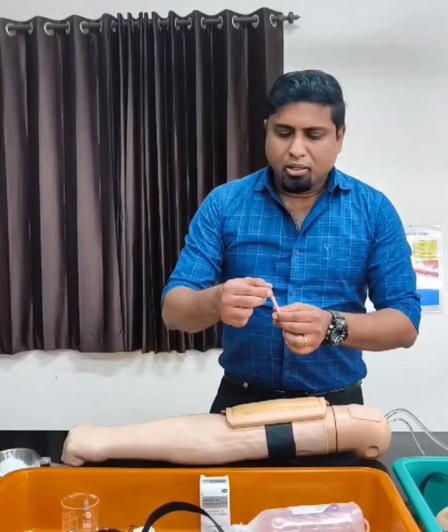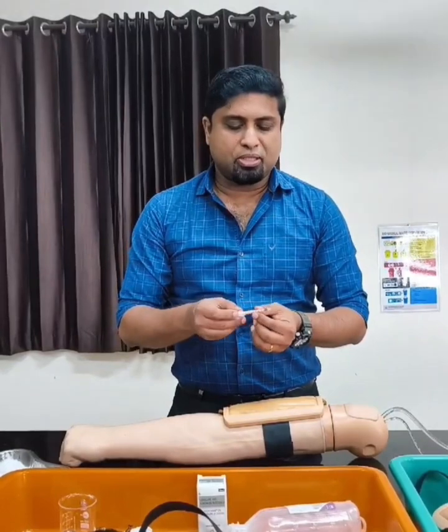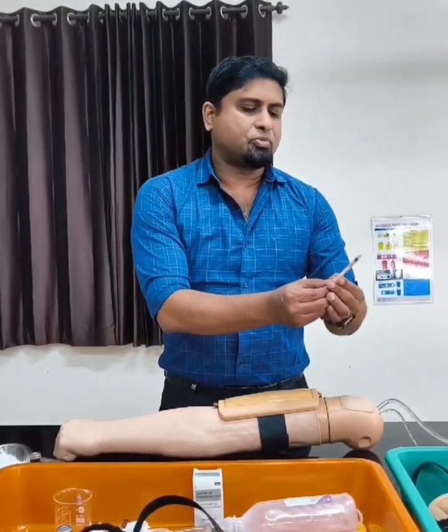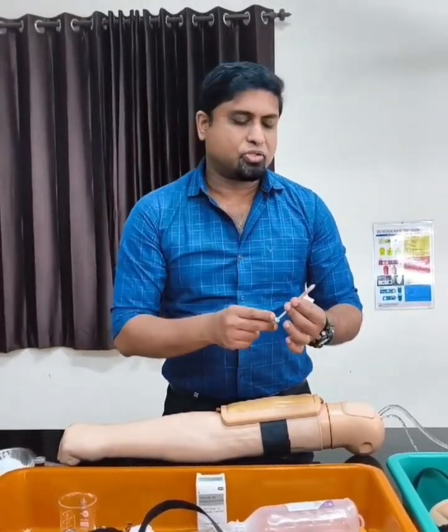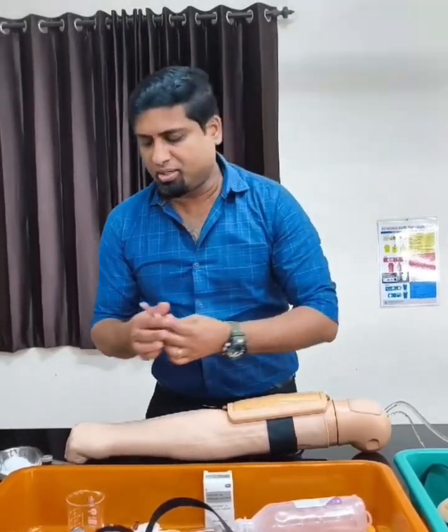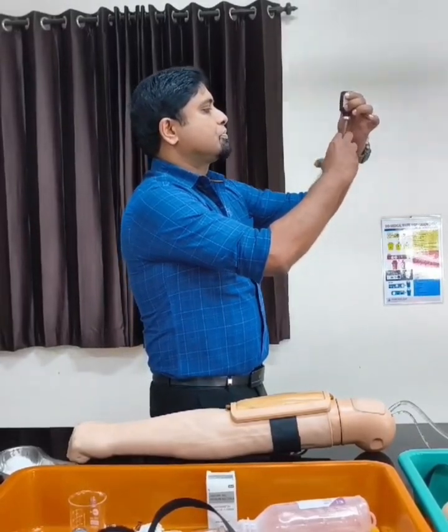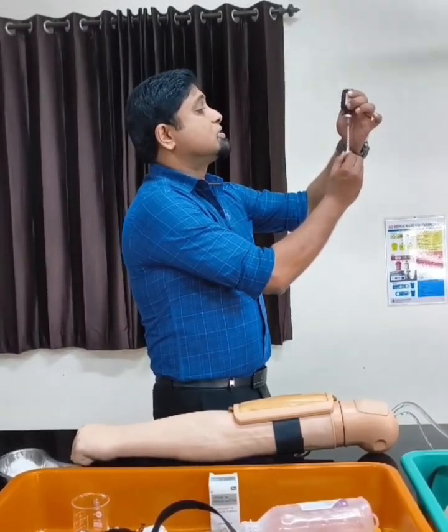So, the patient should be advised to draw insulin from the vial. So, let us say the patient has to introduce 20 units of U40 insulin. In that case, the patient has to first aspirate 40 units of fluid. So let's change it. Let's say that the patient needs to introduce 10 units of insulin. In that case, the patient has to withdraw, aspirate 10 units of air, invert the vial and hold it at eye level in this way. Introduce the needle, inject the air into the vial, and then withdraw carefully the required amount of insulin, which in this case is 10 units.